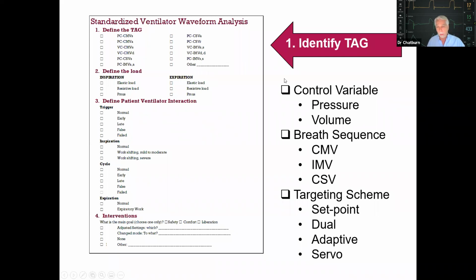And the fellows and the respiratory therapists at our institution have been thoroughly trained in this, or at least we're in the process of doing that, so they can look at just the waveform and come up with a generic classification of the mode, independent of what the manufacturer calls it.